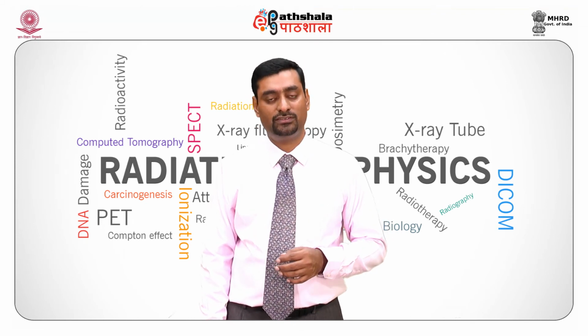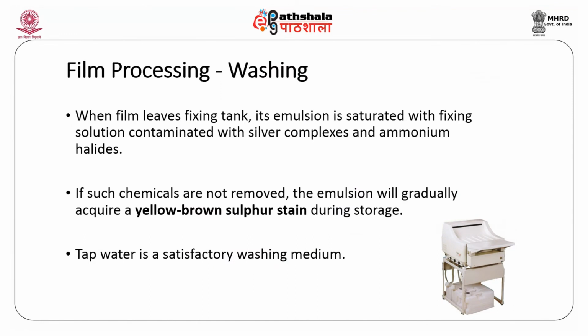Finally, we move on to washing. When a film leaves the fixing tank, its emulsion is saturated with fixing solution. This is contaminated with silver complexes and ammonium halides. If such chemicals are not removed, the emulsion will gradually acquire a yellow-brown sulfur stain during storage, because we have to think about storing these films long term, that is archival. Hence we need to clear whatever is unnecessary in the film. Generally, tap water, running water, can be used as a washing medium.